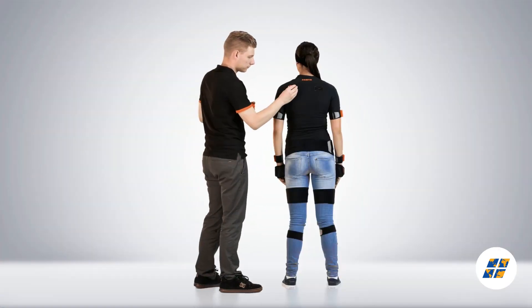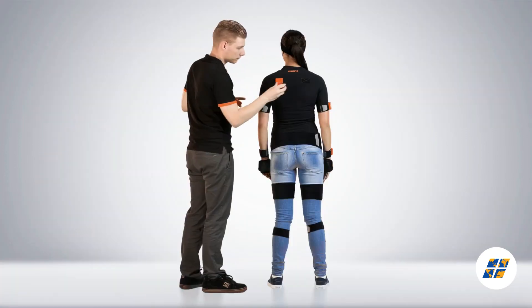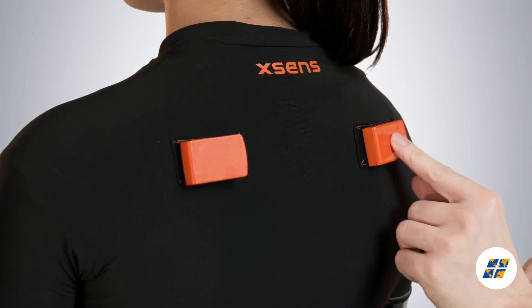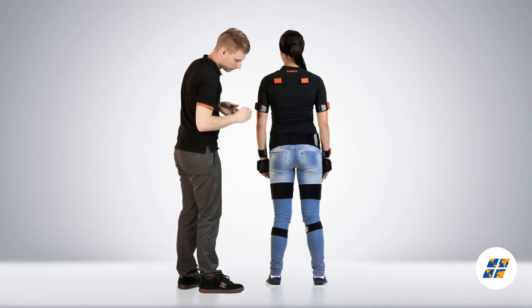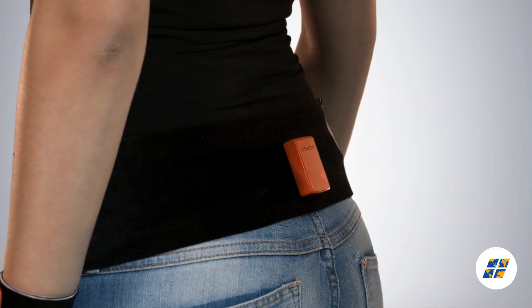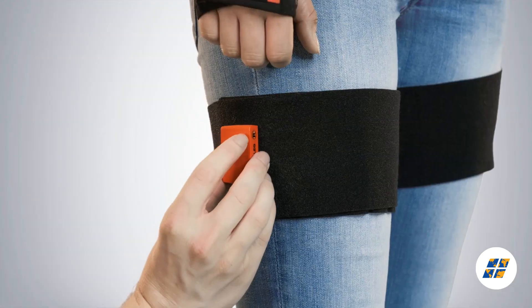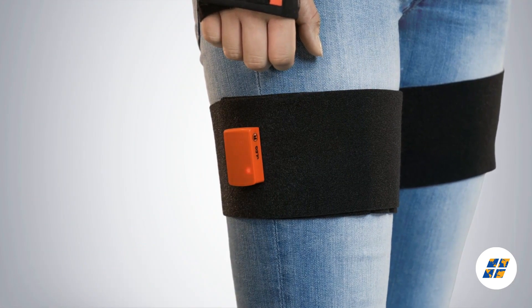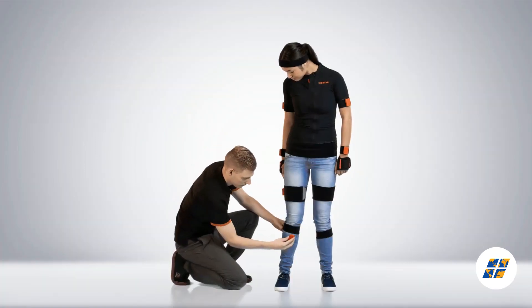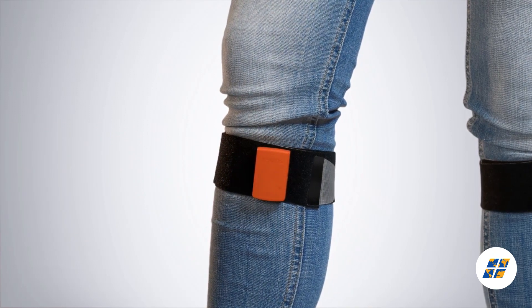Both shoulder motion trackers can be placed. The pelvis tracker needs to be placed on top of the sacrum. The upper leg motion tracker needs to be placed on the flat surface, well above the knee. The lower leg motion tracker needs to be placed on top of the flat surface of the shin bone.